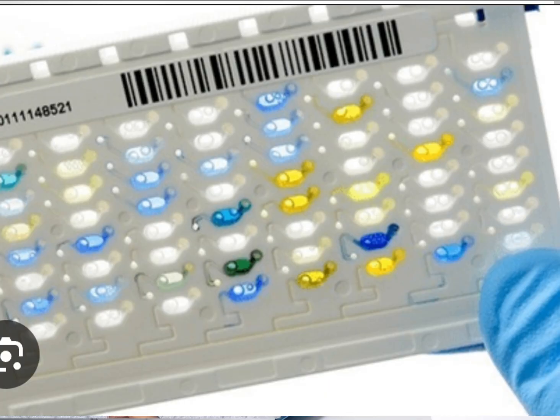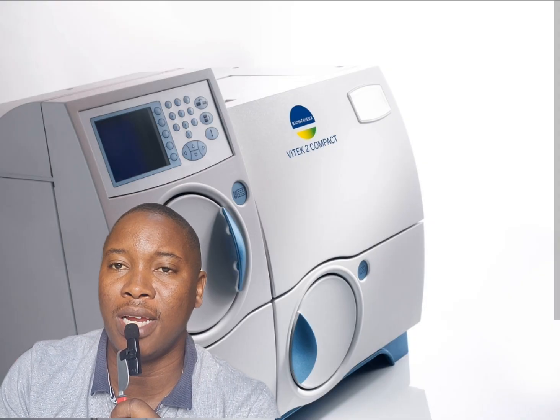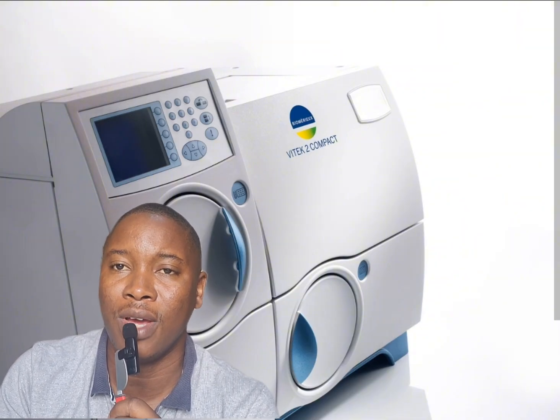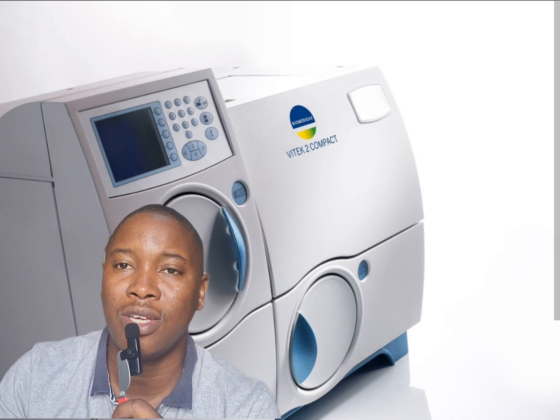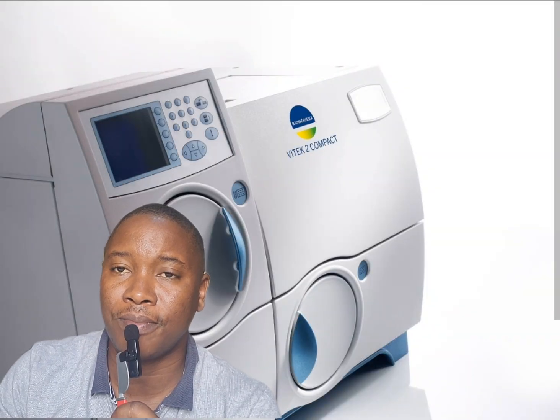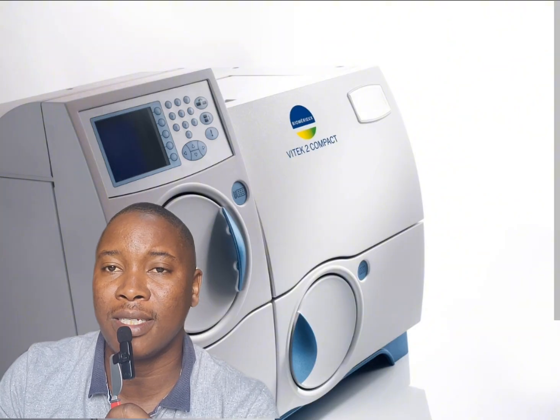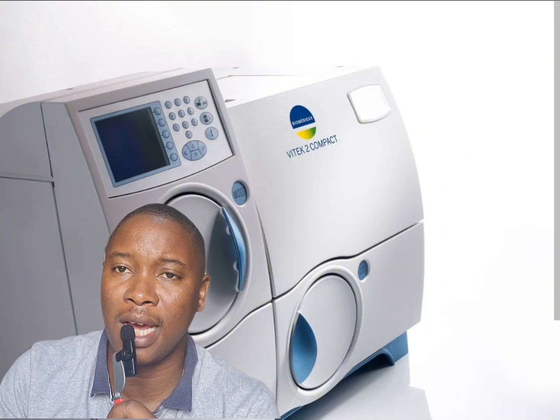And so you also put in your organism of interest into this card and then fit it into the machine, and it will generate a result for you. After about 16 to 18 hours of working, it generates a result for you. And in that result, you see RIS. So you see resistance, you see intermediate, and you see sensitive. So the idea is you can now look at a group of antibiotics, and the results will tell you the antibiotic that is effective against this your organism of interest, and the antibiotic that will not work against your organism of interest. So the Vitek 2 machine is an important machine.